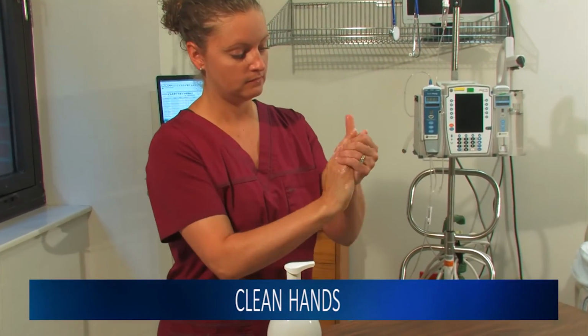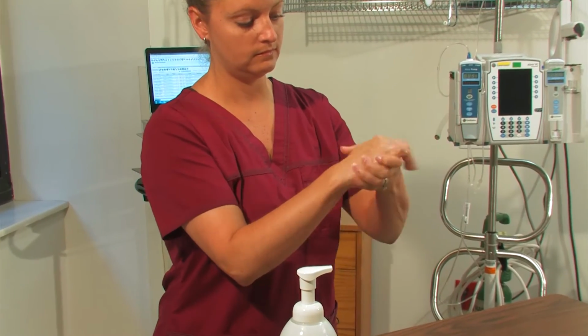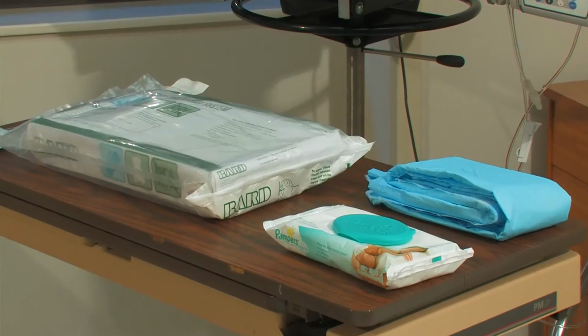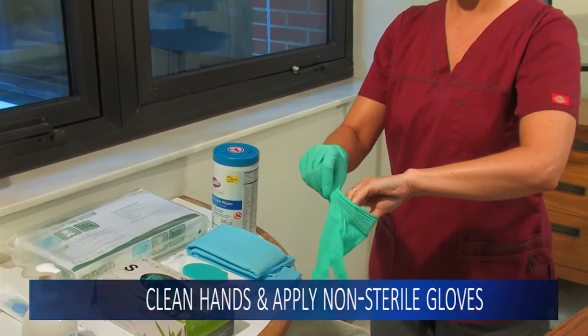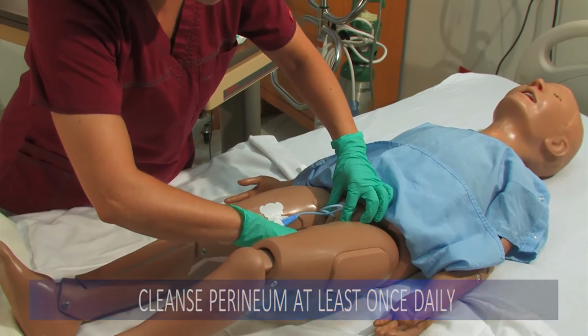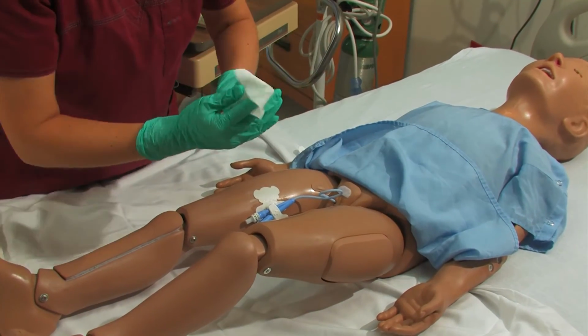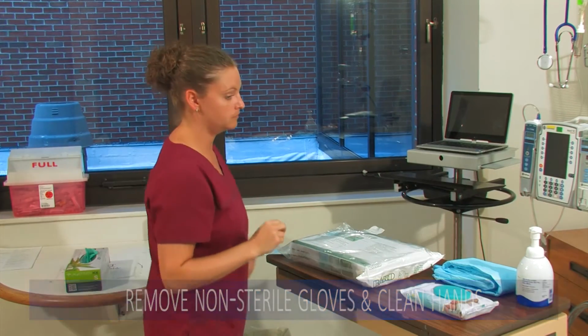Clean your hands with soap and water or use alcohol-based hand sanitizer. Prepare supplies on a clean work surface. Next, put on non-sterile gloves. Cleanse the perineum per your hospital's practice guidelines. Remove non-sterile gloves after perineum and catheter care and clean your hands.